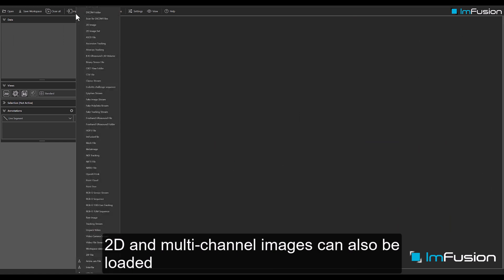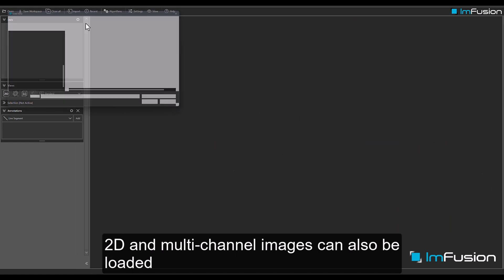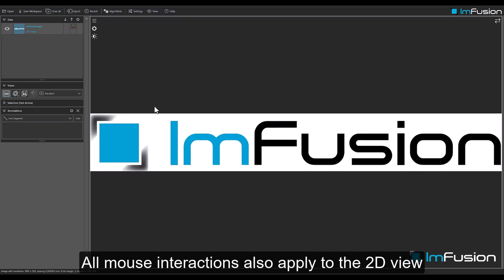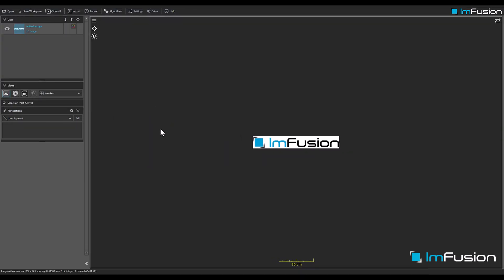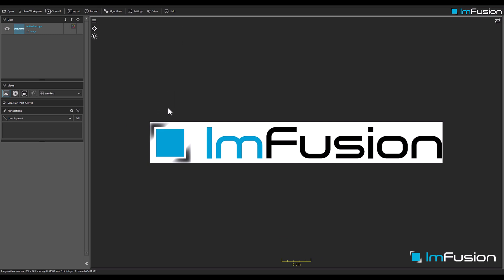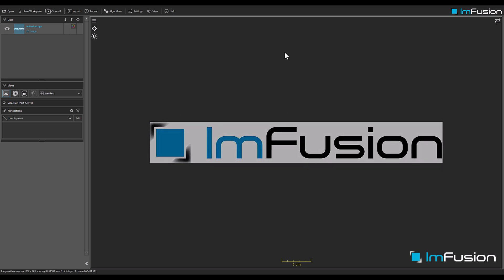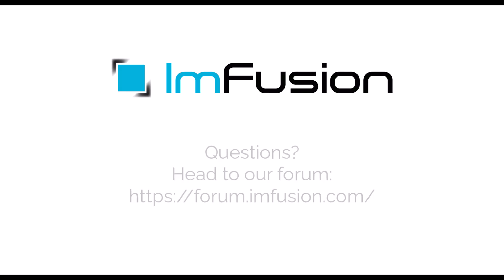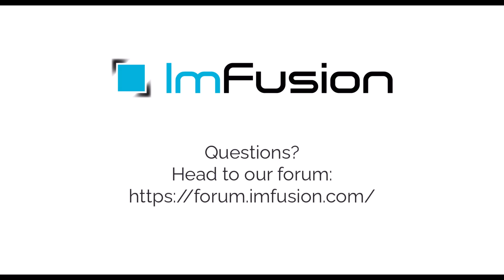2D and multi-channel images can also be loaded. All mouse interactions also apply to the 2D view. If you have any questions, head on over to our forum.